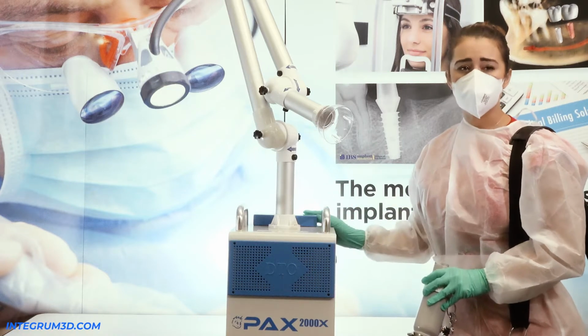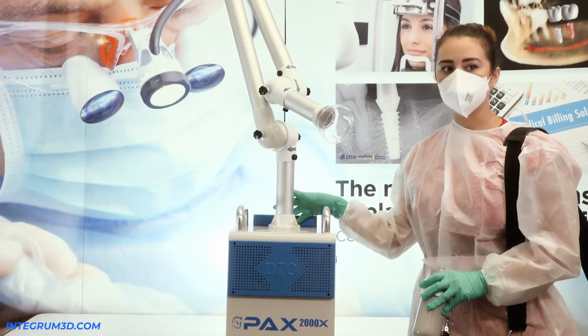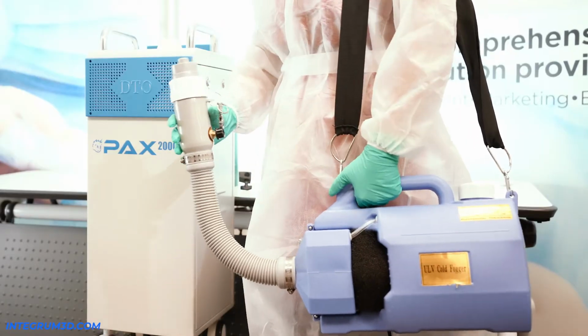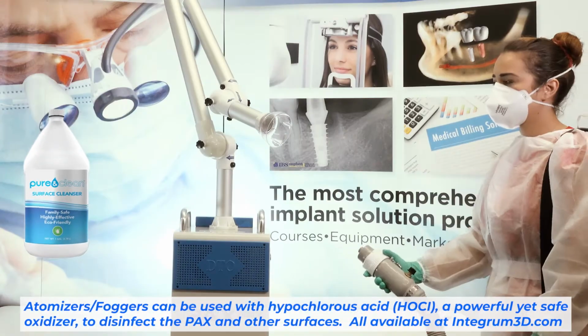As an additional option after wiping down your machine, while the suction is running for 5 minutes, you could use your atomizer or fogger to completely fog the machine down.